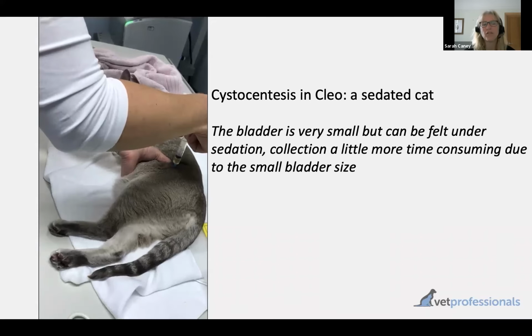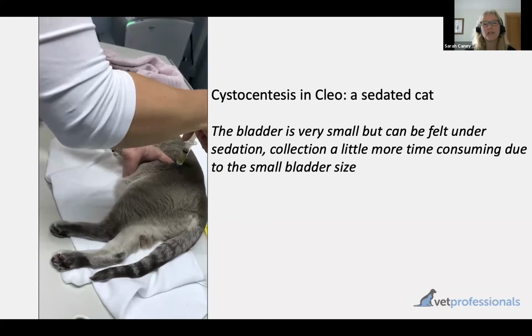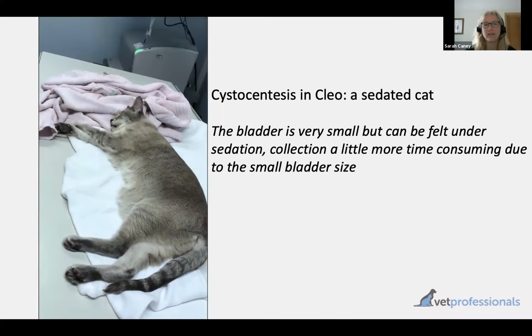And there's a little bit of a sort of jiggle needed after that initial sample has started to come through, before which I can get the rest of the sample, and I'm happy I've got enough for my analysis. And happily for urinalysis as well, we don't need very much of a sample. A few mils gets you everything that you need to do.